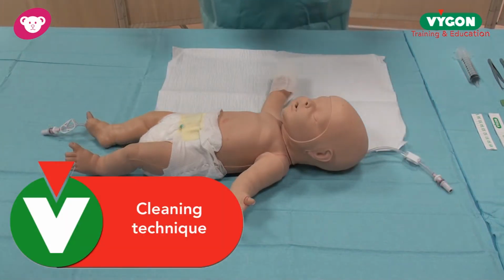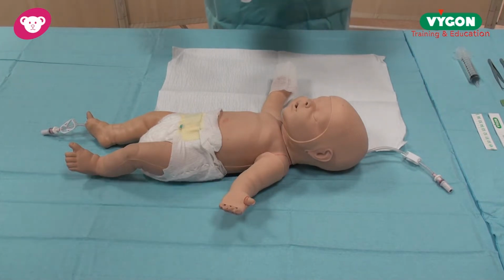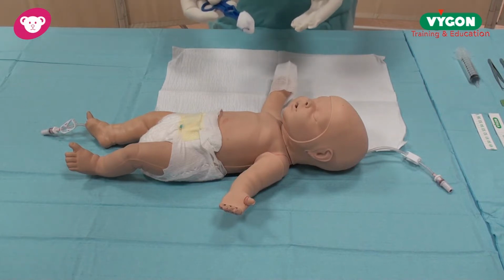I'm now going to demonstrate the cleaning technique for the placement of a PICC. Please note the baby's arm has already been washed with warm soapy water and dried prior to the use of povidone iodine or chlorhexidine, your choice. Please note I'm double gloved.